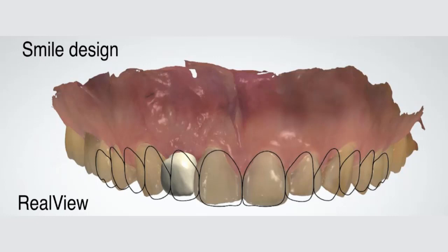One thing that I always do when a patient comes looking to change or to make just one single unit in the front region is to smile design the patient. I'm not going to show smile design here. That's not the purpose of my presentation. But I would like you to always think about looking at the patient, even for a single restoration, from outside to inside. So get a face picture, and do a smile design of the patient very fast. The software available can really give you a very fast design that gives a sense of where you are. It doesn't need to be so perfect. Perfect could be the next step.